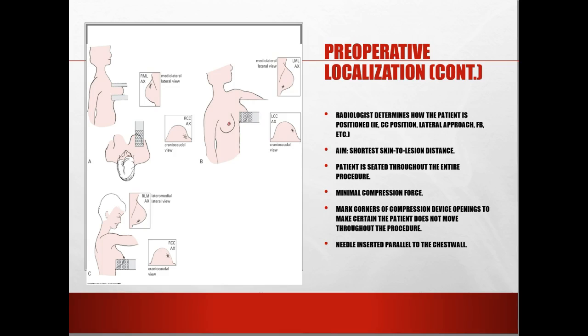The reason being, and you'll read this in the book, is you don't want to get the needle or the hook close to the pectoral muscle, because as you can imagine, that muscle contracts, and depending on the motions that the lady's doing and with breathing and everything, if that wire starts to migrate a little, it can be caught by the muscle tissue, and then it's going to move into the muscle tissue. So the needle should be inserted parallel to the chest wall.